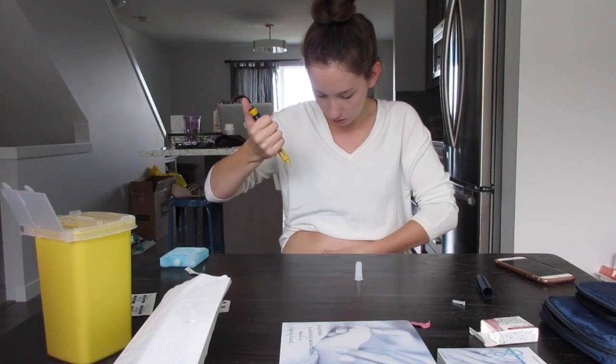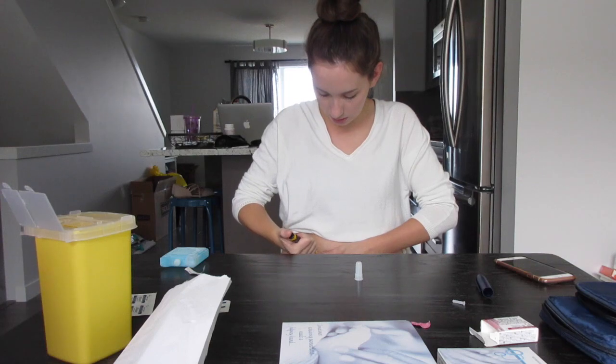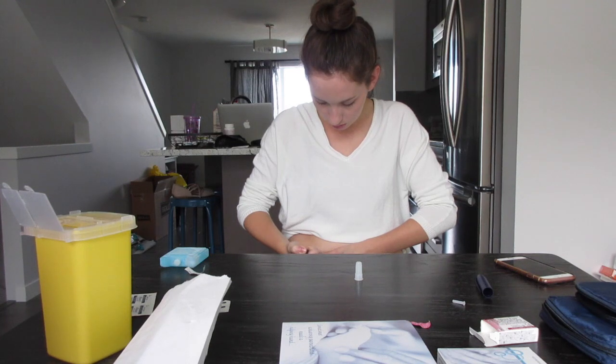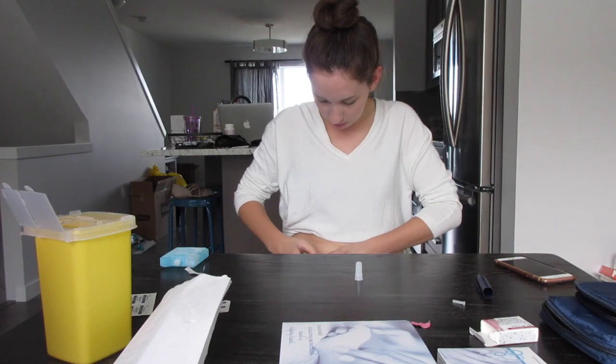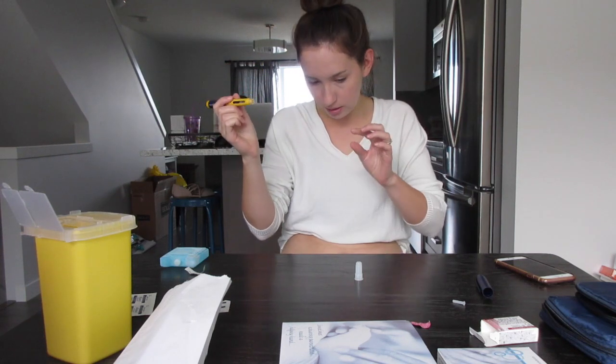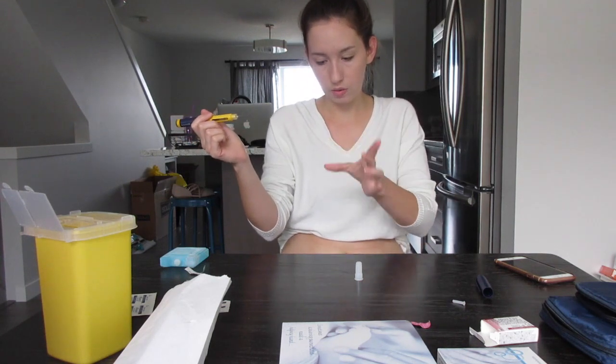All right, so you take a chunk of your skin, you find a spot that you want, you make it kind of taut, and you push in nice and straight. You push down, you'll hear the clicking. Usually want to count to five. Then I like to make my skin stretch so that when I release the needle, it is harder for it to hit anything on the way out. So I just stretch the skin with my fingers.